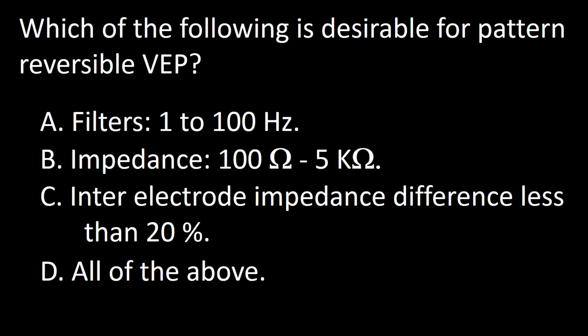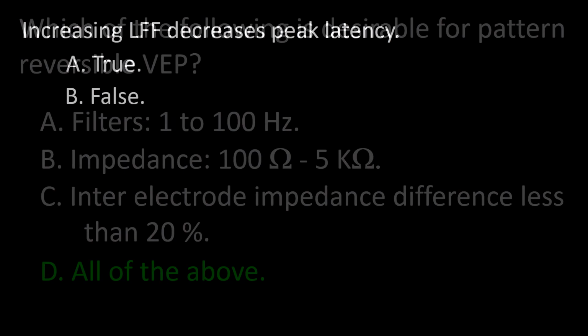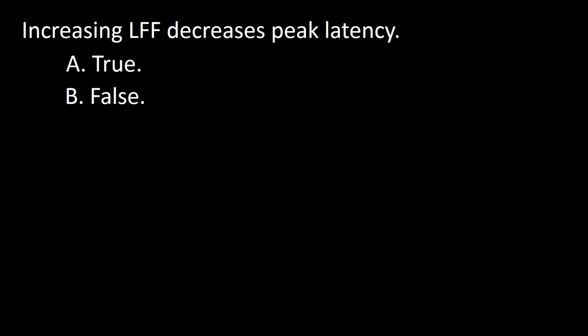So the answer to this question is D. Next question. Increasing the low frequency filter decreases the peak latency. A true, B false.